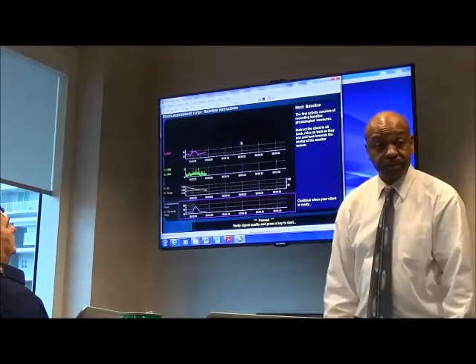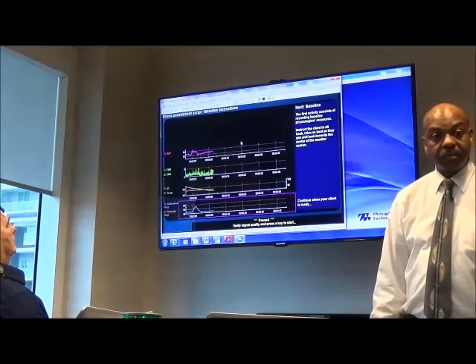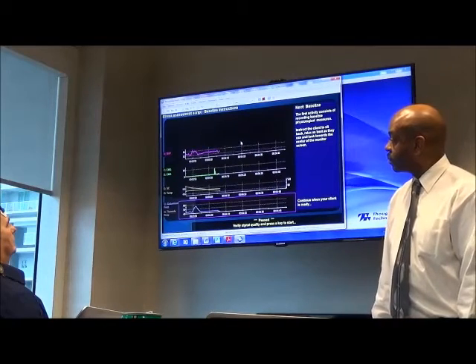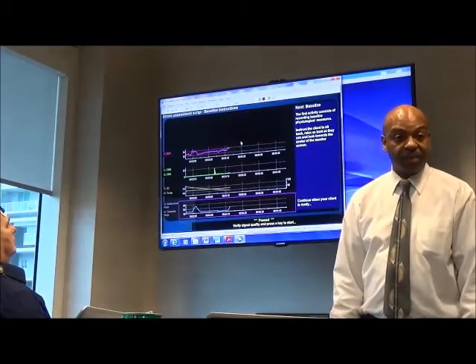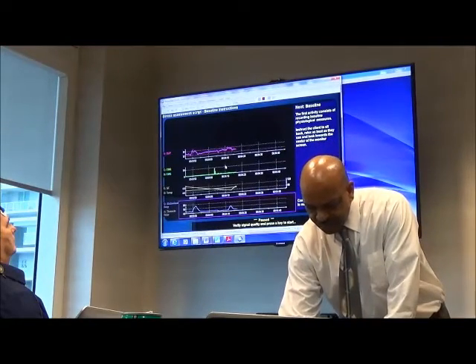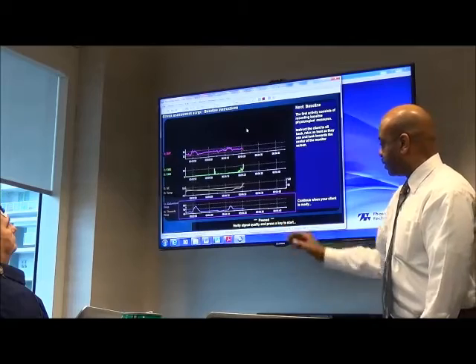So for the EMG, every time he talks or every time he blinks, that would create these spikes. The spikes are due to the blinks, eye blinks. And those are things you want to take into consideration. Okay, so now I'm going to go ahead and press a key to start.